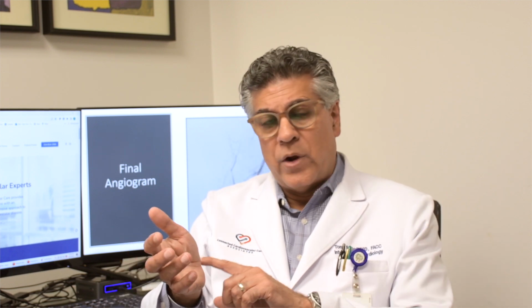As mentioned previously, after the nurse puts in the IV and after you get to the heart catheterization lab, you'll be on the table where we actually do the procedure. There'll be an x-ray tube that comes over the top of you, and there'll be lots of equipment in the room. The first thing we will do is prep the location where we're going to go in. As mentioned, we can go in through the wrist, which is actually very easy on the patients, or go in through the groin. We choose one or the other based on where we want to actually evaluate the arteries.